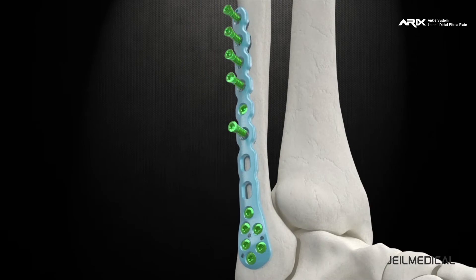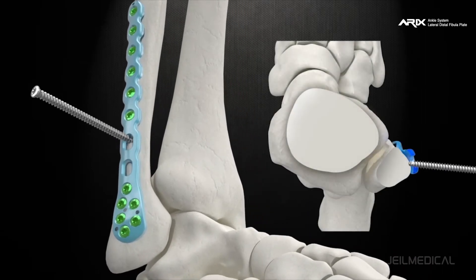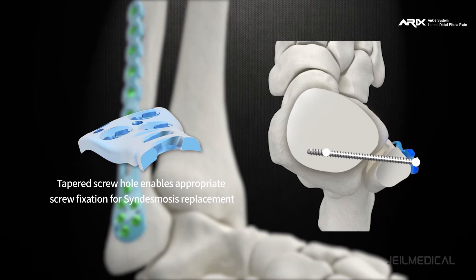Two oblong holes in the distal shaft are used for the insertion of the syndesmosis screw. The screw insertion angle is maintained at 30 degrees from the perpendicular insertion, allowing screw insertion towards the center of the tibia.